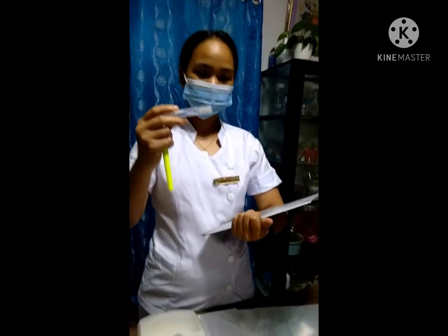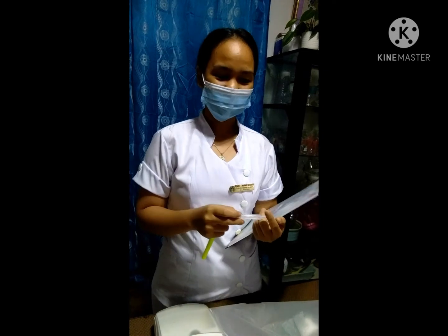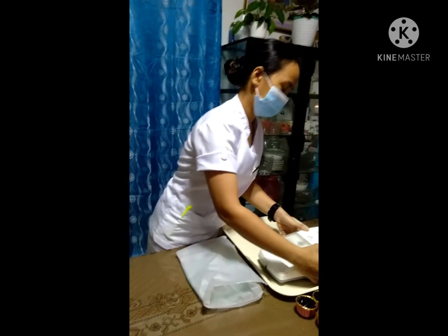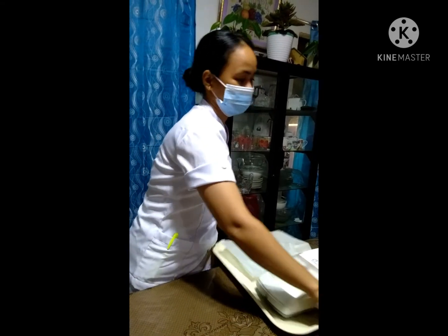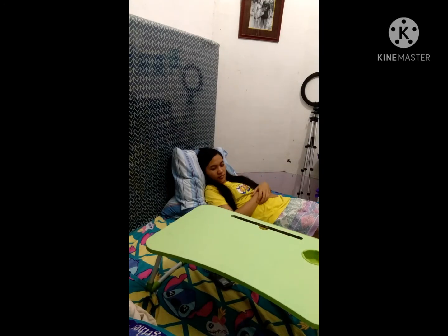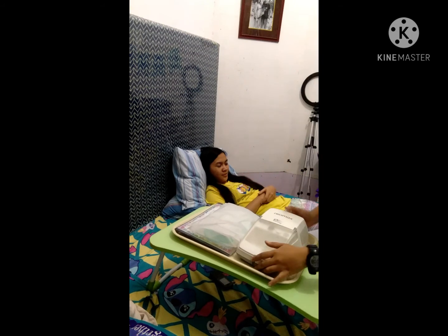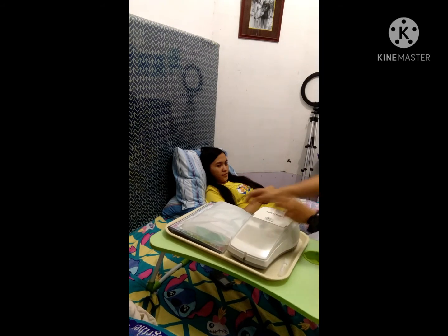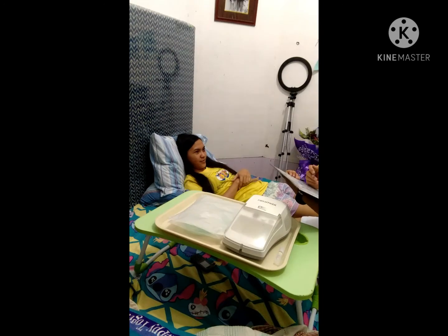Also important to know the actions, special nursing considerations, safe dose ranges, purpose of administration, and adverse effects of the medication to be administered. Place medication in a tray or move the medication cart outside the patient's room. Organization facilitates error-free administration and saves time. Medications will be transported to the patient's bedside carefully and kept in sight at all times. This is to prevent accidental or deliberate disarrangement of medications.